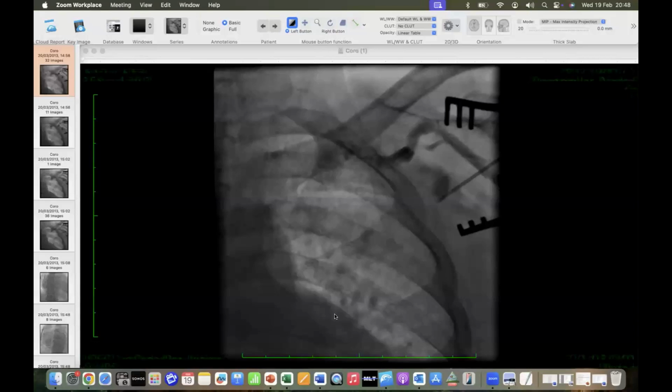Able to see the screen at the moment? Yep. It's sort of frozen, but it's frozen. Excellent. I haven't started playing the venogram.